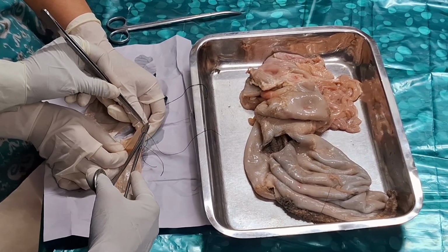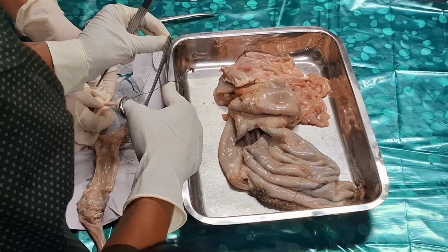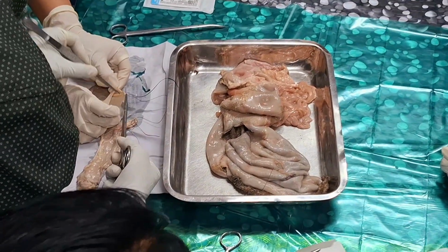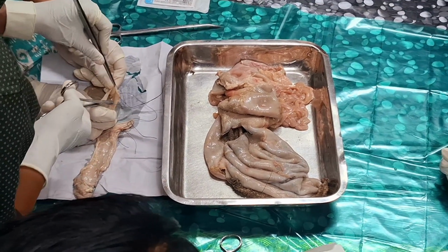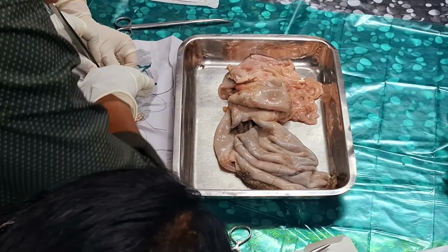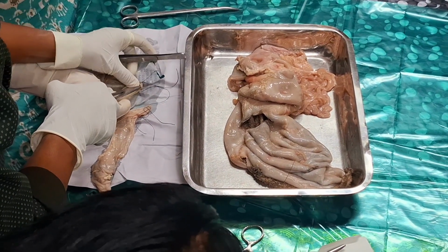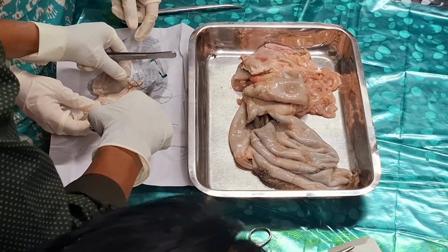Then the adjacent bowel also: out in, first out in, then out. Go like this.